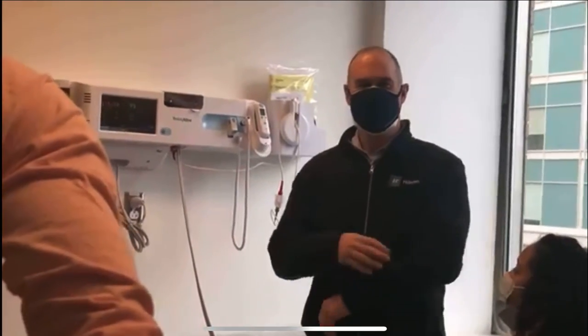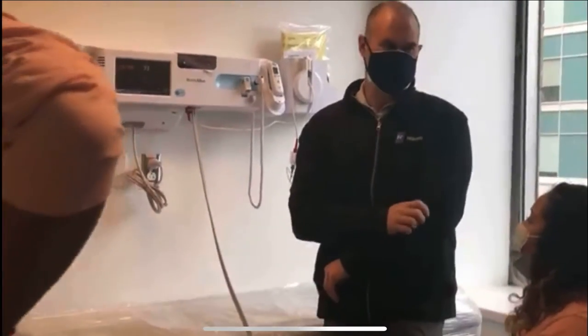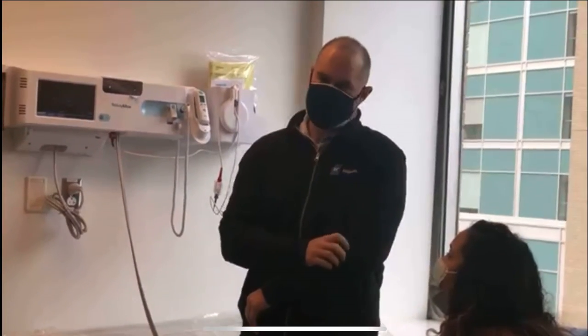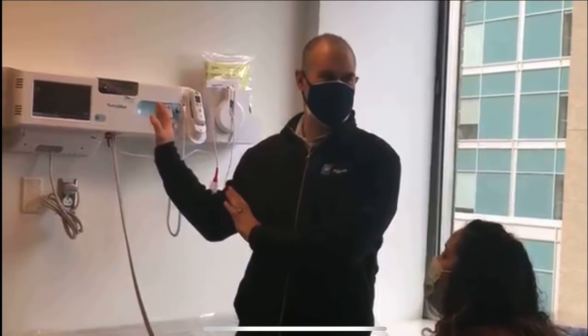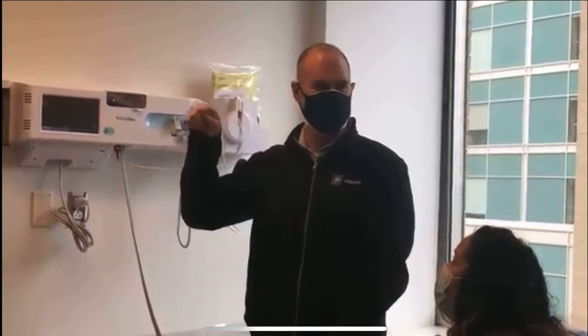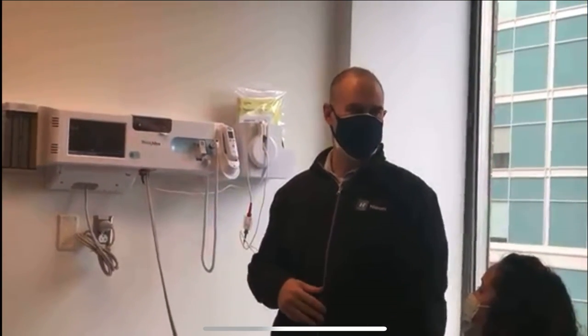It's nice to have — it'll be a last resort if that's the case. You need to go to the next room and do another patient while this patient is waiting — yeah, I totally understand. It's there. The start button for the initial one will just do a single one in 20 seconds. Your workflow would dictate which way you choose to go. Of course.